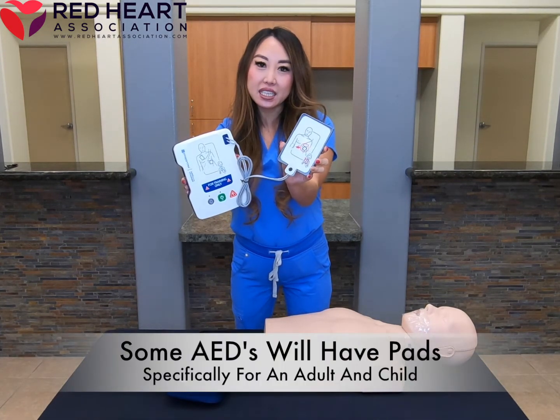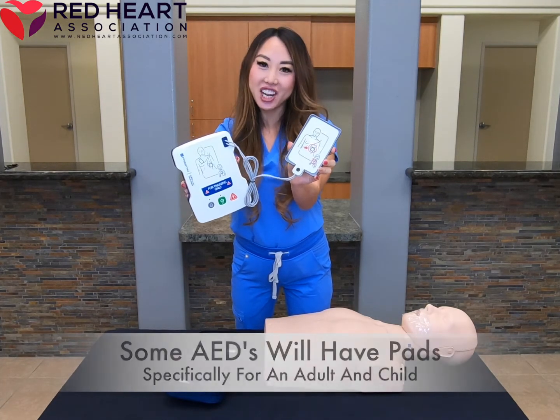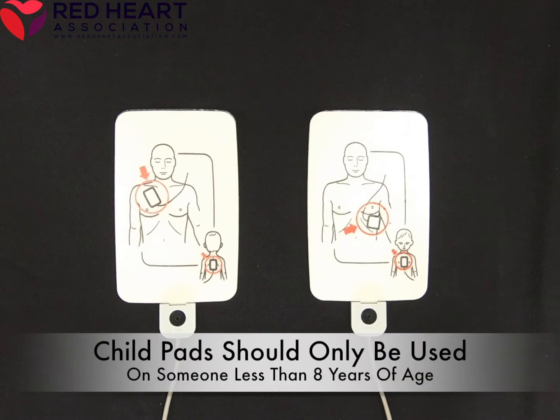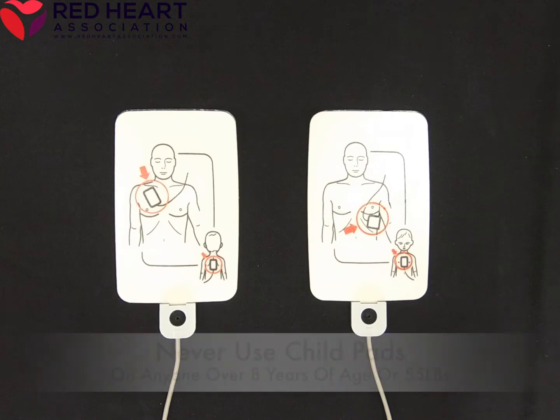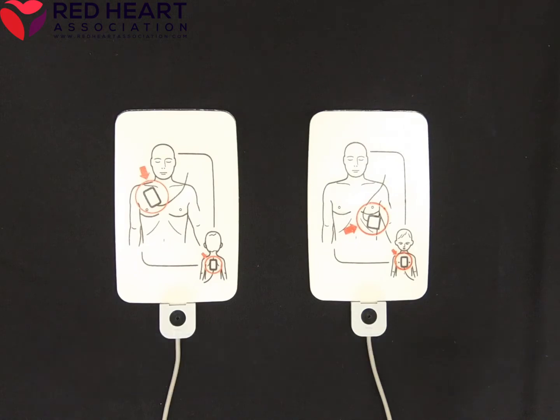Some AEDs will have pads specifically for an adult and child. Adult pads should be used on anyone 8 years of age or older. The child pad should only be used on someone less than 8 years of age. If the age is unknown, use the adult pads to ensure enough power is provided. Never use child pads on anyone over 8 years of age or 55 pounds in weight.